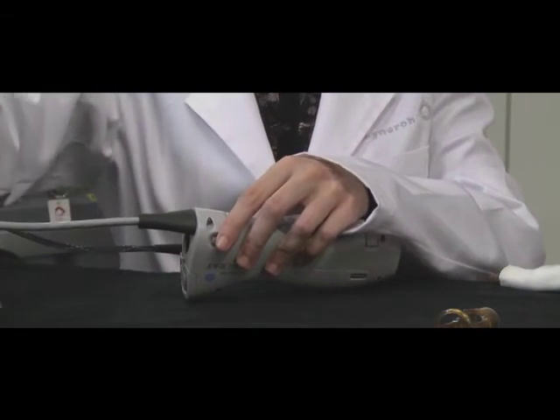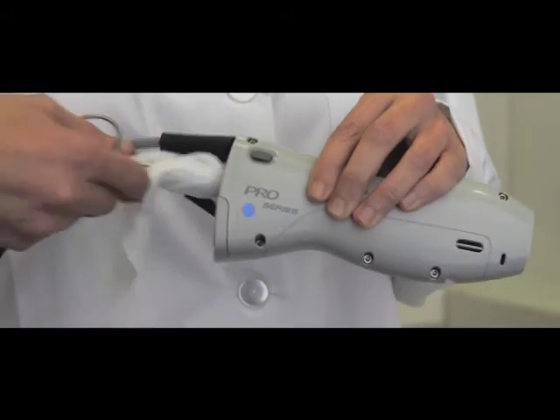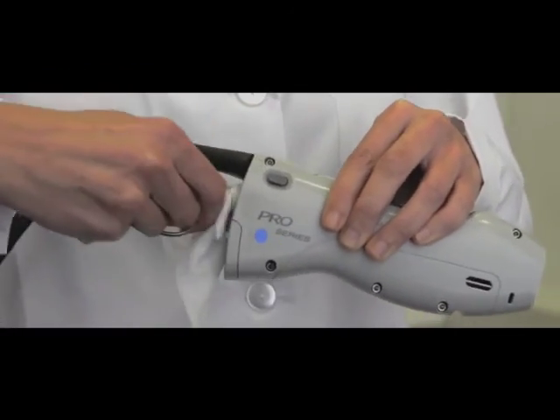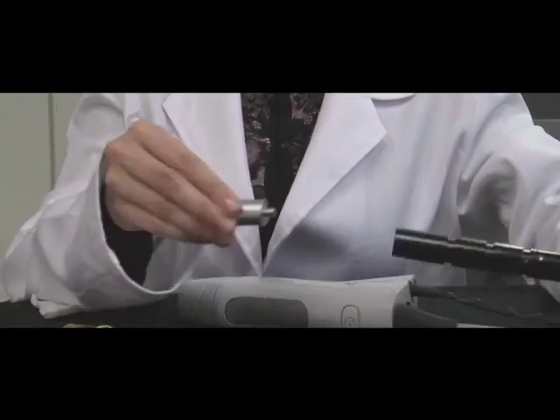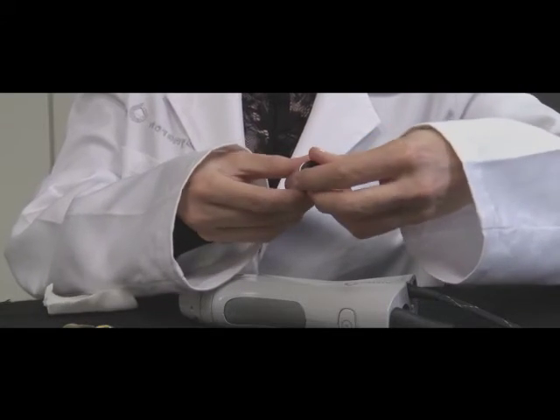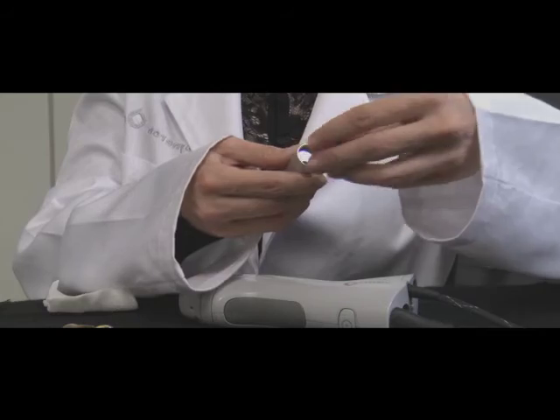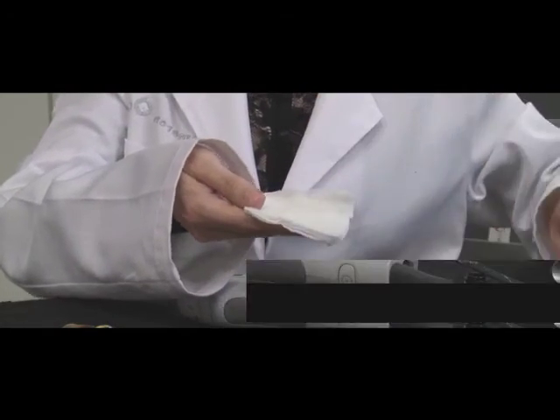It's important to clean the handpiece area that houses the slider by removing the slider and the external window. Clean the inner portion by wiping like this. Be sure to clean the outer part of the slider and check the slider window. This should be done between patients. The slider window should otherwise be removed and cleaned daily.